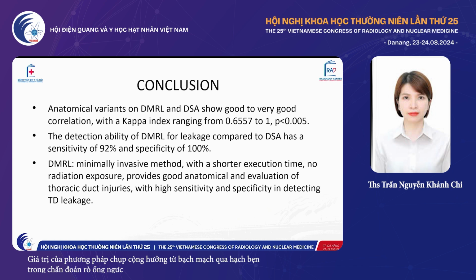Dynamic MRI lymphangiography is a minimally invasive method with a shorter execution time, no radiation exposure, and provides good anatomy and evaluation of thoracic duct injury. This is truly effective in planning interventions and treatments for patients.